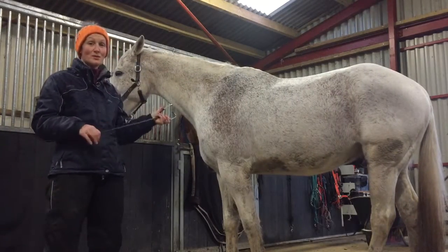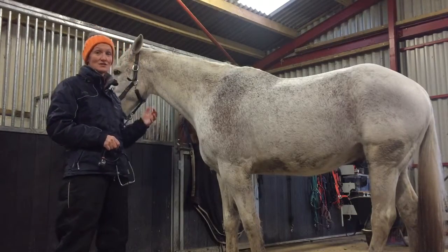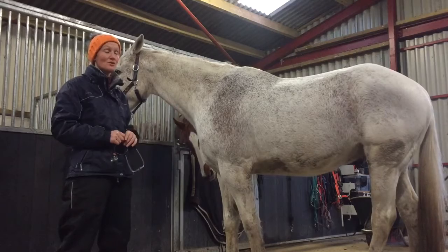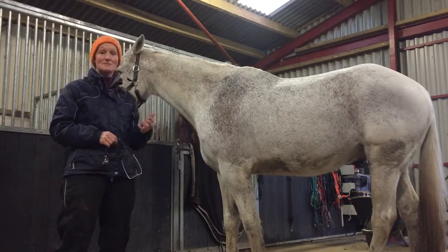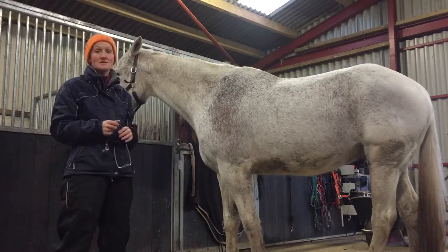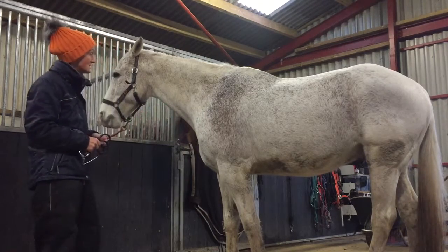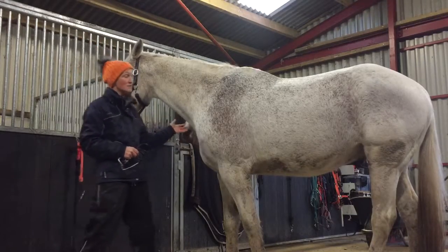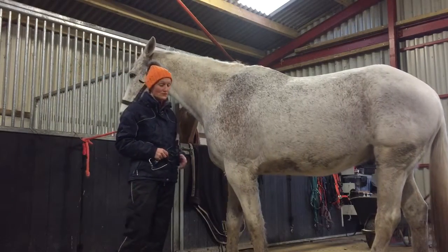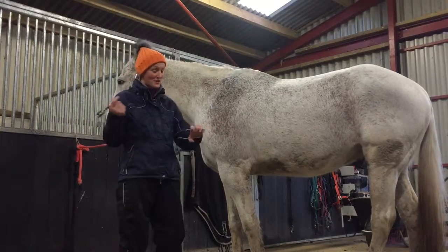Part of my role at the vet school is to teach students what normal is and how to do a normal examination of a horse. We use simulators and mannequins to teach skills such as taking blood samples. Anything that's invasive we do on mannequins and simulators, and anything that's non-invasive we can teach on live animals — dogs, cats, and anything else we use for teaching.